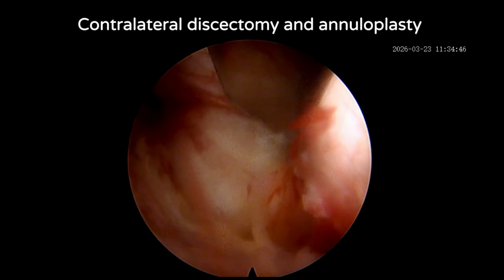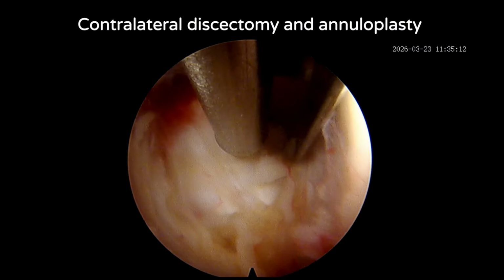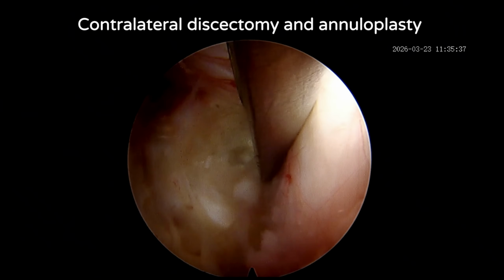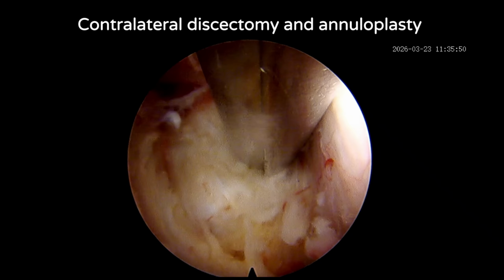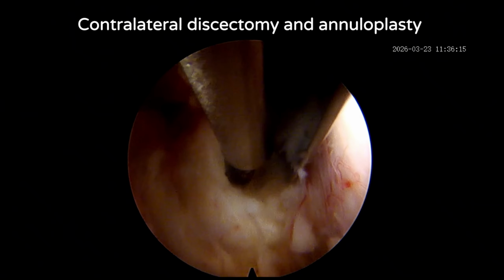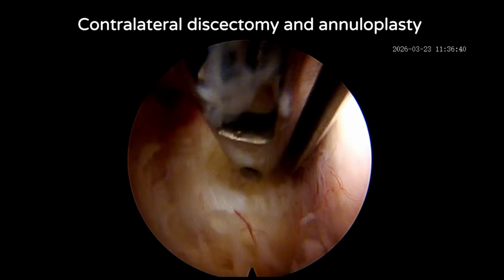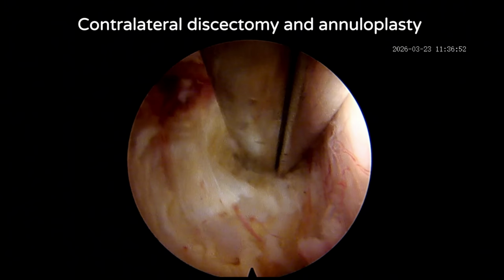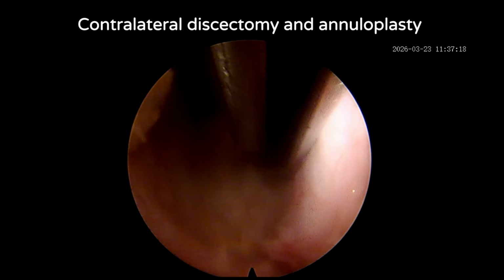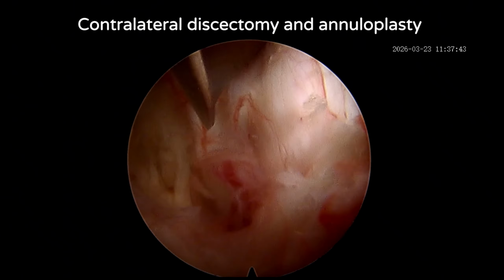The same thing should be done on the contralateral side. Using the nerve root retractor sleeve, you can retract the contralateral traversing nerve root. Then for neovascularization at the annulus, you can do the radiofrequency ablation, put your annular cutter inside, and start doing the discectomy. Once discectomy is done, do the annuloplasty, free the contralateral nerve root and do the bilateral traversing nerve root decompression. So these are the steps with which we do our surgery.